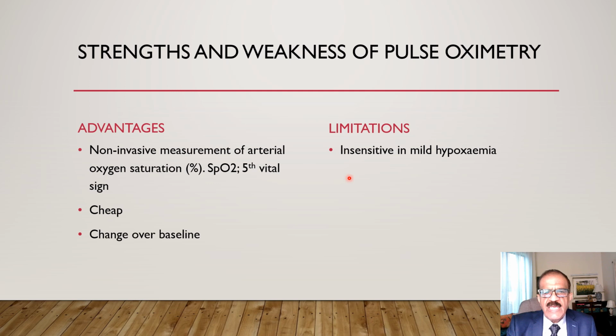Limitations: it is insensitive to mild hypoxemia. By showing you the oxygen dissociation curve, I demonstrated that the oxygen level can drop significantly. It can come down from 100 to 70, whereas saturation will drop only from 100 to 92, 93. So mild hypoxemia can be missed.